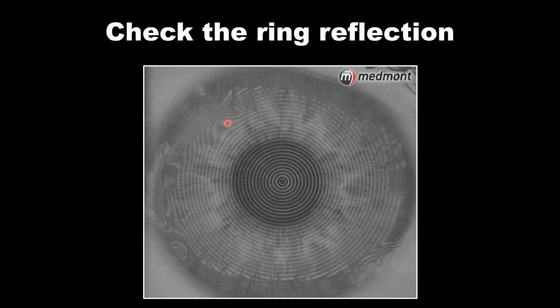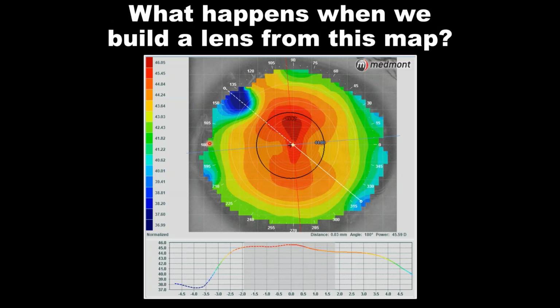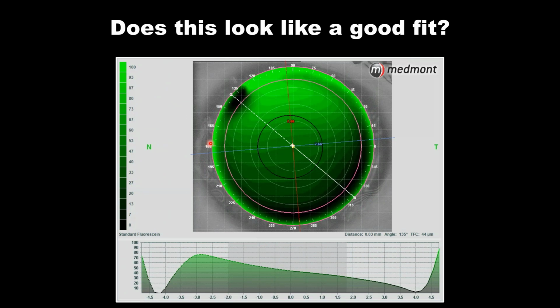Our slit lamp indicated that this patient had healthy epithelium, and there's no history of any disease or trauma or infection in this eye. So why do we have this odd area? It must be poor tear film. So if we were to take this topography and attempt to build a contact lens from it using the contact lens software, you notice something is amiss. We have a with the rule cornea where the lens should land at 3 and 9 o'clock, but because of this false hotspot, this false high spot, the lens appears to want to have a bearing point on that high point and then finds an opposing point down here. Remember, again, this is a with the rule cornea. The flat meridian is very close to 0 and 180, so the landing of a rigid corneal GP should be along the flattest meridian, 0, 180, not at around 1030 and 430.